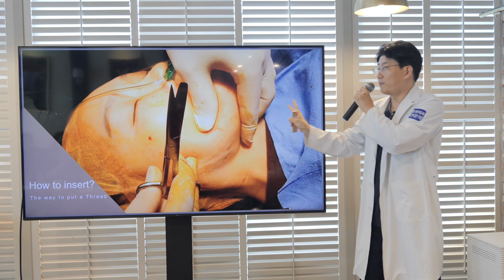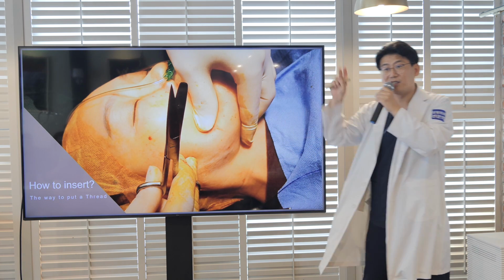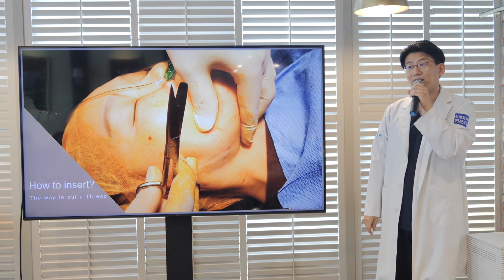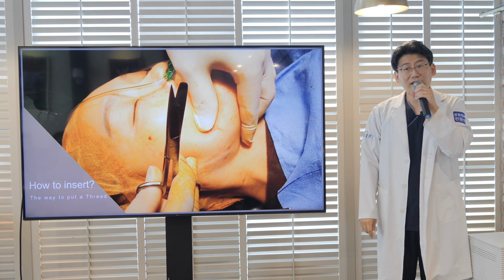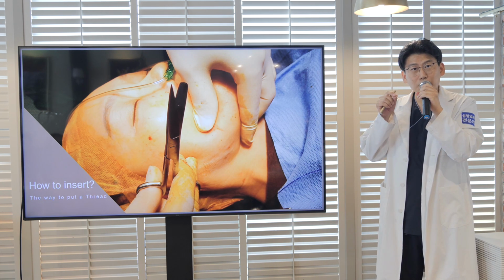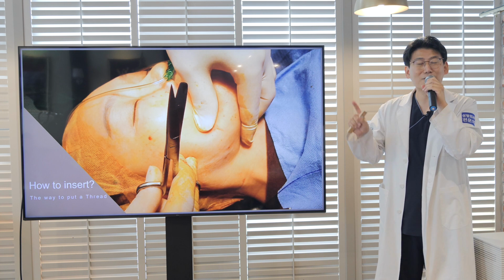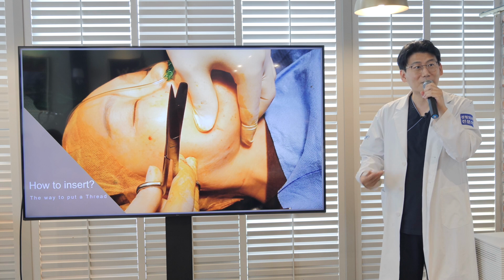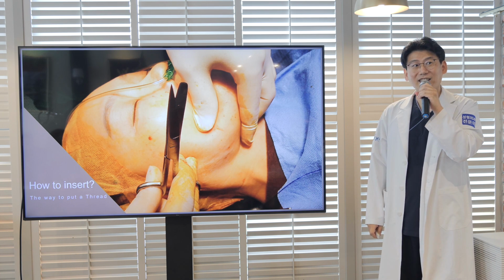Pull and press, then cut with the scissors. Simple. Rub to restore the dimpling. Simple. But the layer is also important. It's not simple for the beginner, but if you succeed one time, it's very easy. If time permits, you can apply it by yourself today.